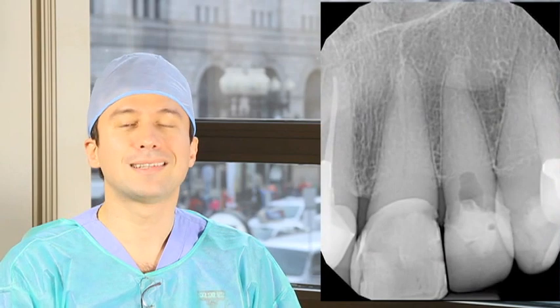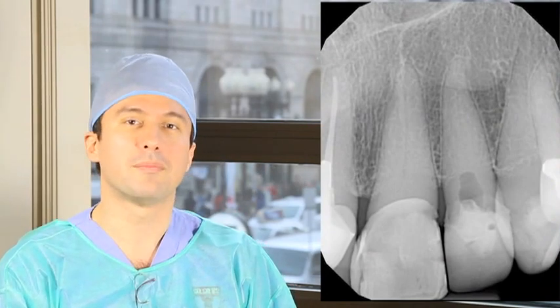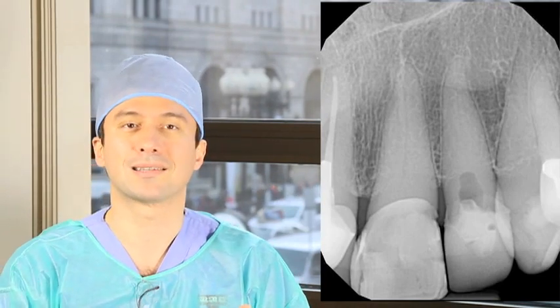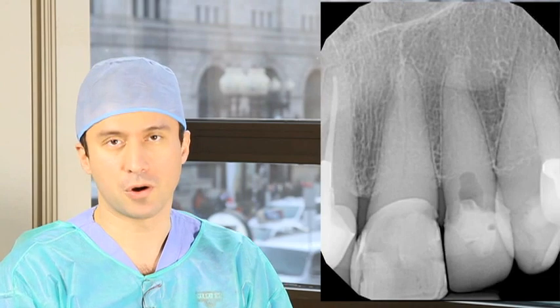Hello, this is Alan Nassar, and I'd like to share another tutorial of an interesting case that I recently did, which involved dystrophic calcification of an anterior tooth. Tooth number 10 was referred to me after my referring dentist attempted to perform root canal therapy but found the canal calcifying. So wisely, treatment was terminated before any procedural errors had occurred, and the patient was then referred for microsurgical access and exploration using a microscope.